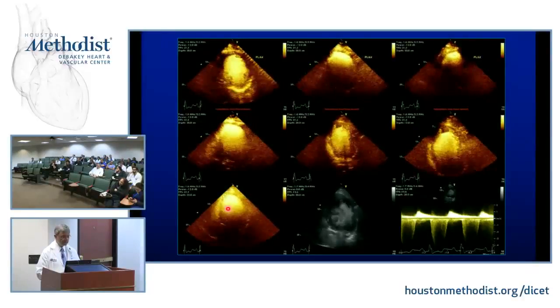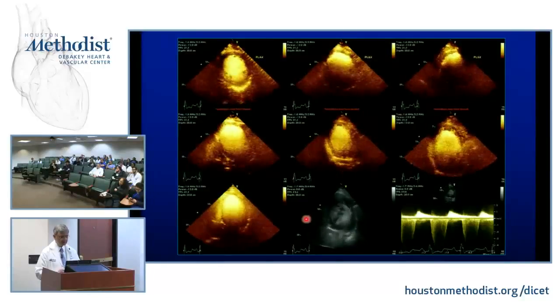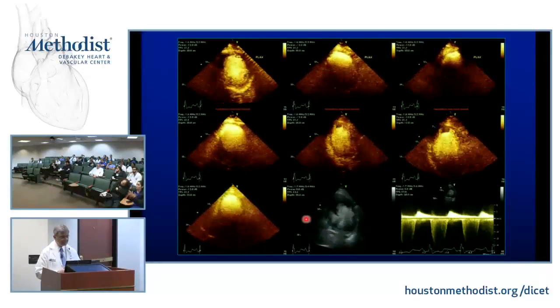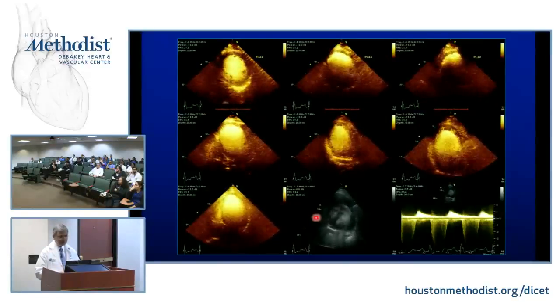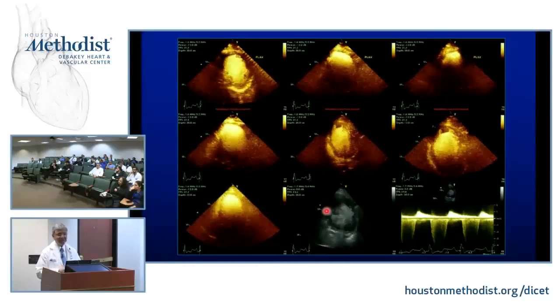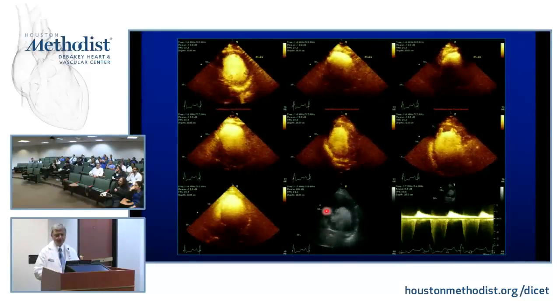Much more bright. High MI, right? It's not even displayed, but I know. So somebody either got anxious about too much contrast, or this is towards the end or whatever it is. But this is very important for you.